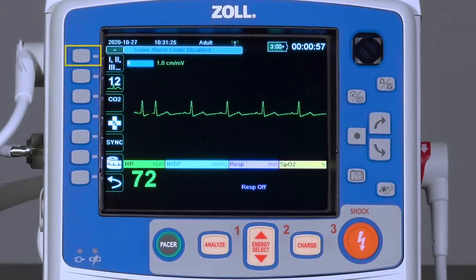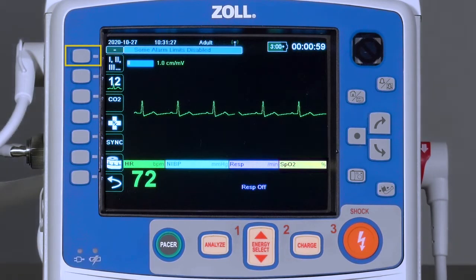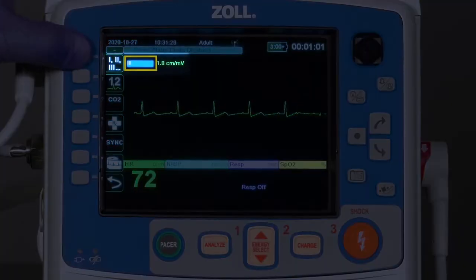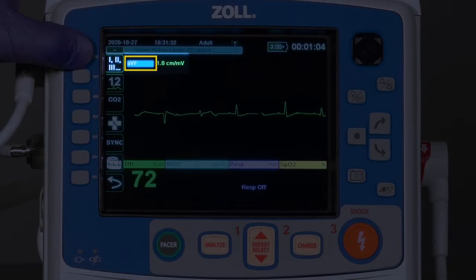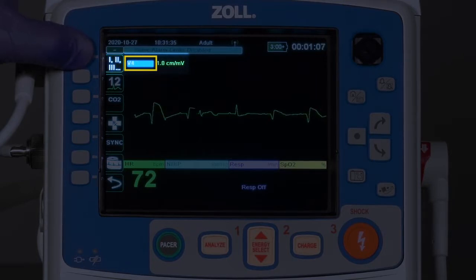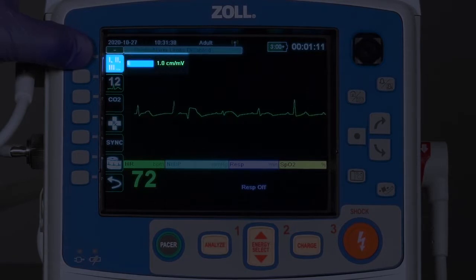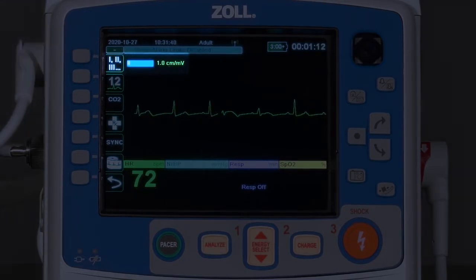By using the lead select button, alternative views can be obtained. Press the lead select button multiple times to scroll through all available lead views, including PADS view and any V-leads attached to the patient.